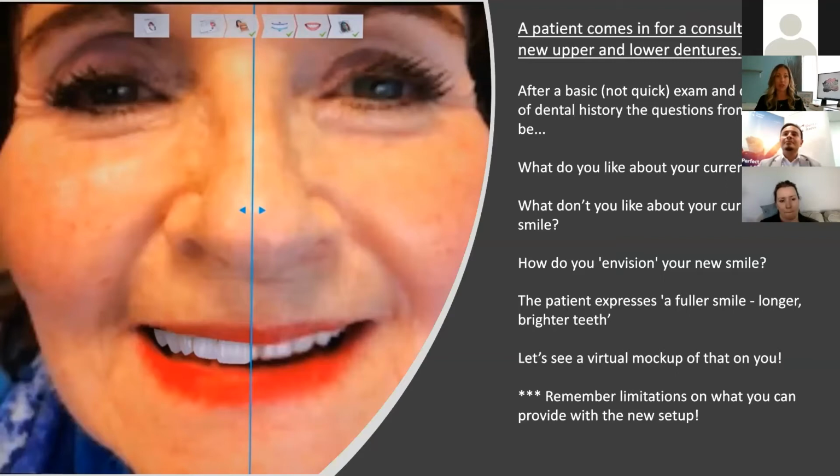Then I get in and I have to take a look at classification of the bite. These are factors that you have to know before you're doing your smile design, so you can work within those parameters. Obviously, if the patient's anterior maxilla is super atrophic, you can't have a super long denture with a 10 millimeter long central. You're not going to have that support. So you have to consider that. And I think we have that luxury, again, as denturists. We've got the clinical and the technical training to accomplish that.